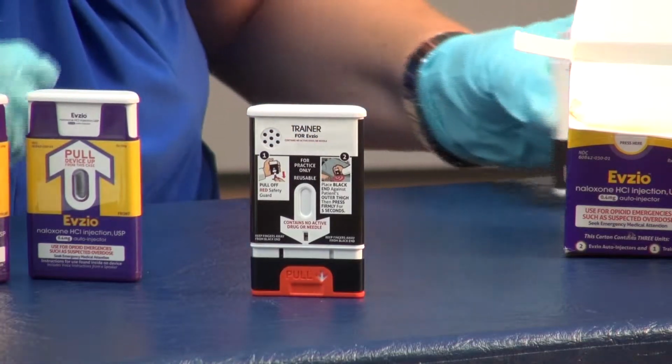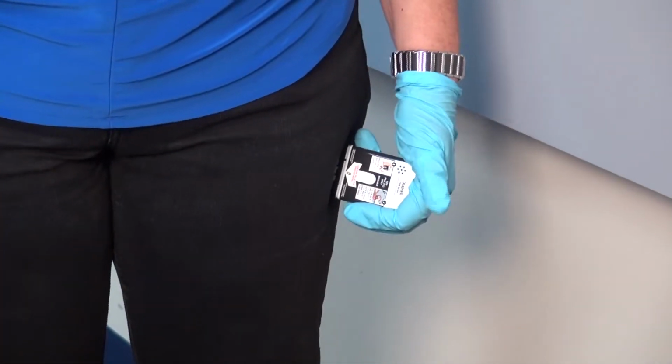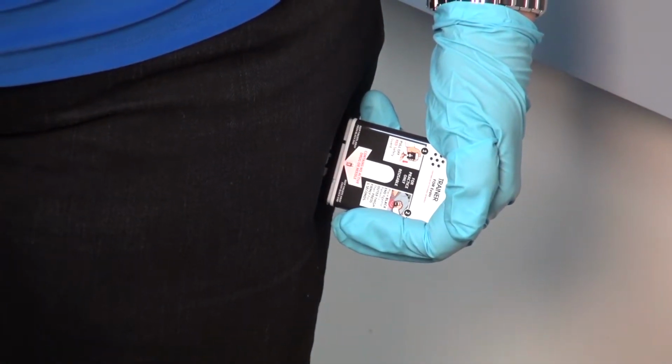This trainer contains no needle or drug. This injection will go through most clothing. 4, 3, 2, 1. Injection complete.